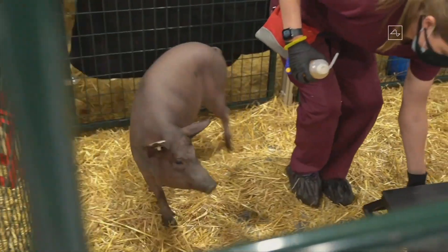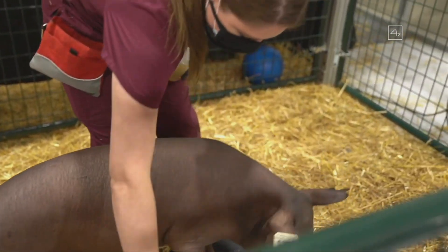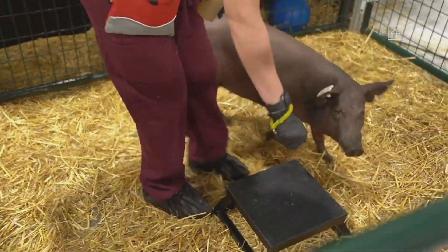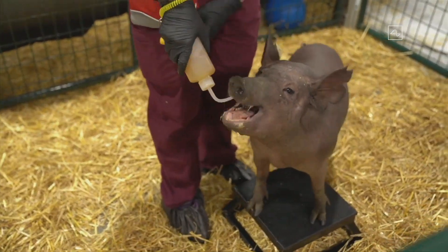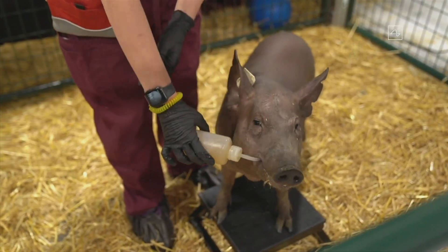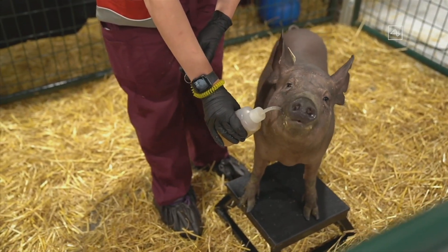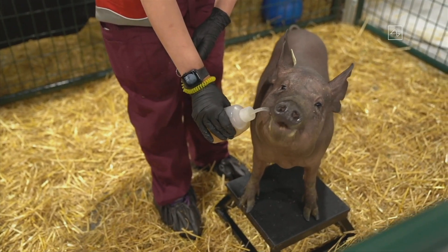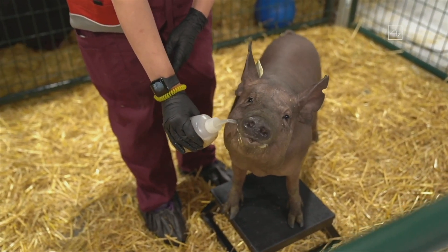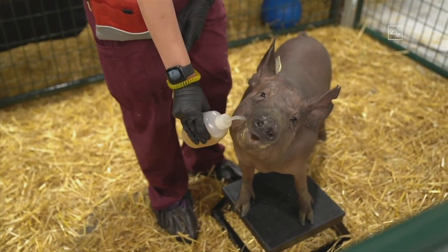Here's Dorothy. Dorothy used to have an implant, and then we removed the implant. This is a very important thing to demonstrate: reversibility. So if you have a Neuralink and then you decide you don't want it, or you want to get an upgrade, and the Neuralink is removed — is it removed in such a way that you are still healthy and happy afterwards? What Dorothy illustrates is that you can put in the Neuralink, remove it, and be healthy, happy, and indistinguishable from a normal pig.